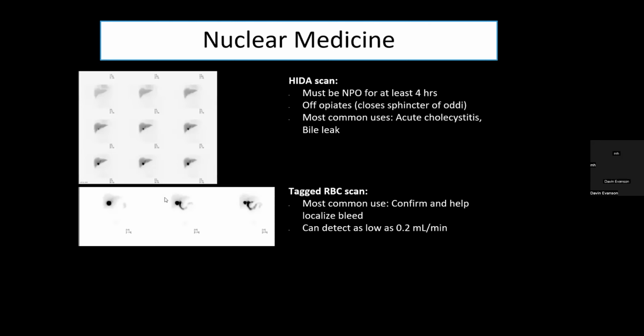Nuclear medicine makes a lot of physiologic sense, and it makes a lot more sense if you actually get to spend a day in nuclear medicine, which I have all my students do. But basically, you're injecting a tracer into the patient, usually tagged with technetium. In this instance, using a HIDA scan.